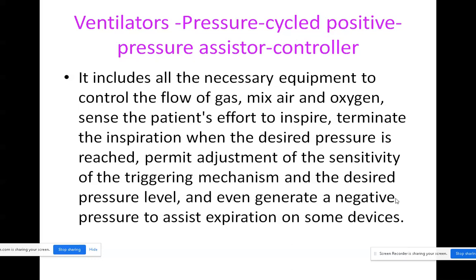It also provides adjustment while you are triggering the device, manages all the pressure levels, and assists the expiration process also. So not only inspiration, expiration is also done by the same device in some devices.